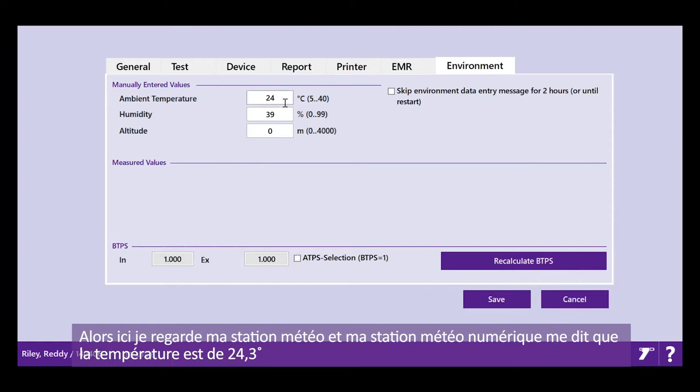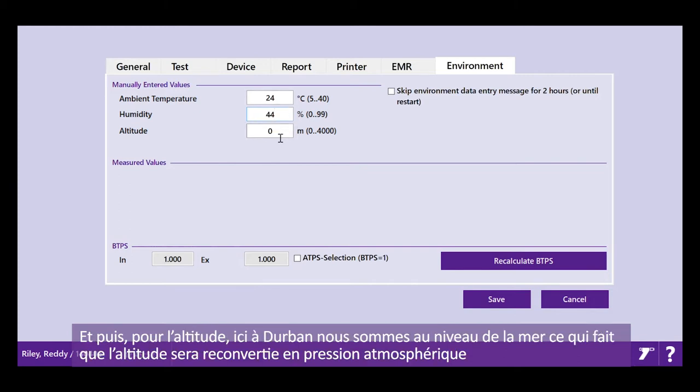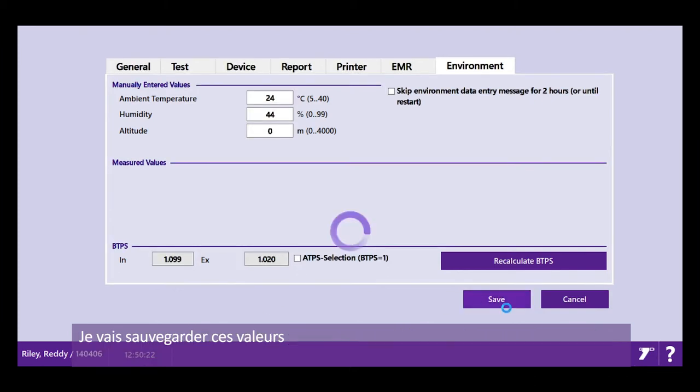I'm looking at my weather meter. My digital weather meter tells me it's 24.3 degrees — this software only takes whole numbers, so I put in the closest number. The humidity is reading at 44%, so I've entered that. The altitude — I'm at sea level here in Durban — will be converted into a barometric pressure. I then press recalculation to activate BTPS. This means the ambient conditions at the time of calibration will be corrected to receive a patient at body temperature, pressure and humidity. I save those environmental conditions.